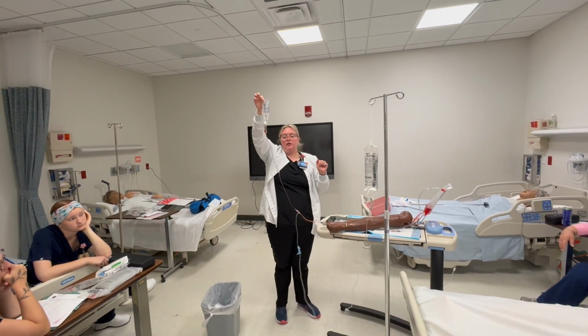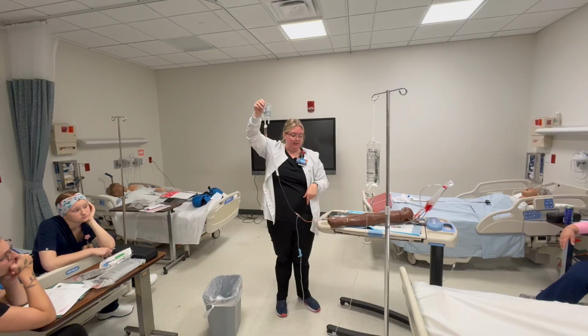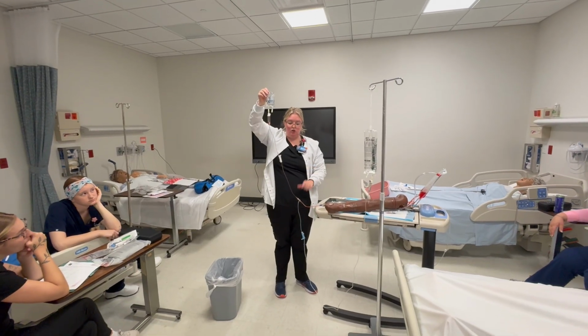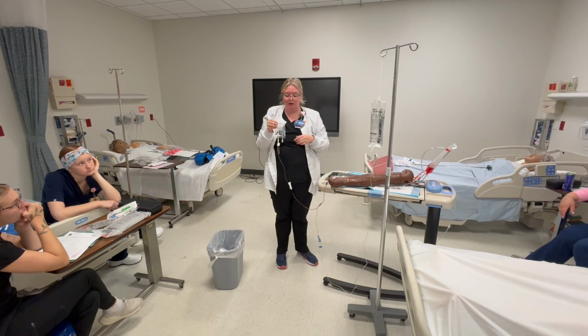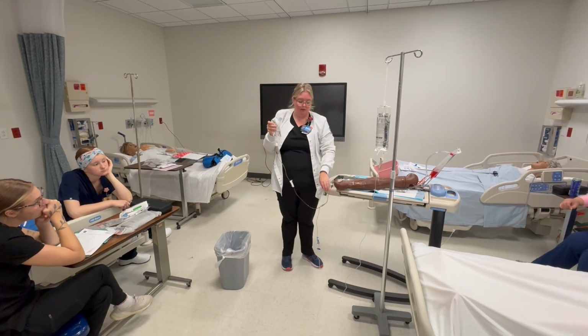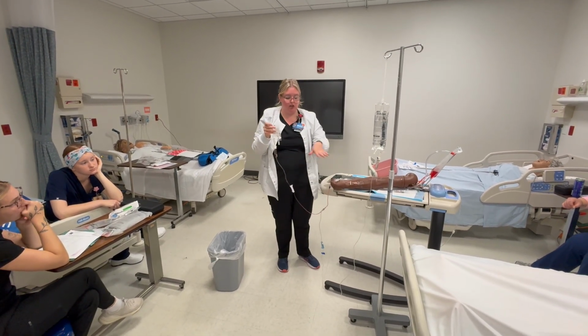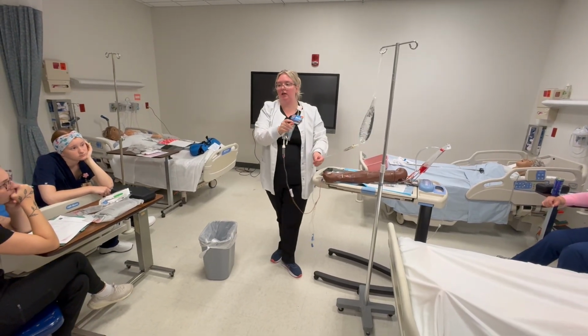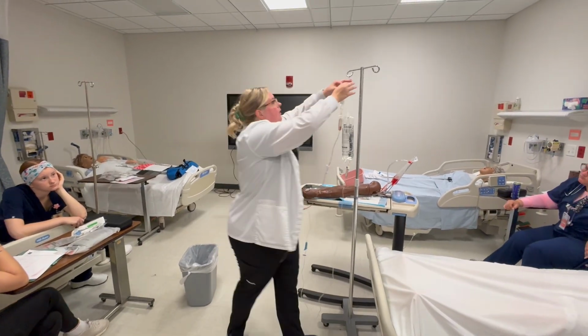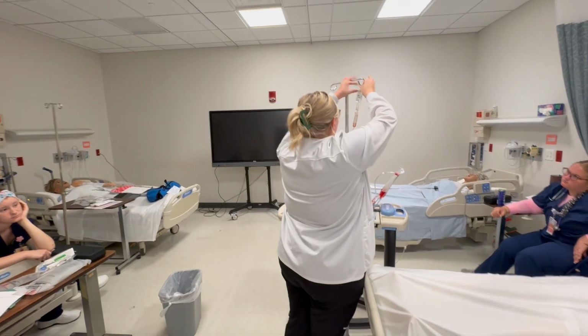That's why it's so important that you clamp it before you connect it, because the minute that you connect this, it's gonna automatically start back flowing, okay? So it's clamped. Again, blood will not rush back. This is just because this port is so low. You use the one that's closest. You guys have a port, it's like right here, okay? We're gonna hang it up.